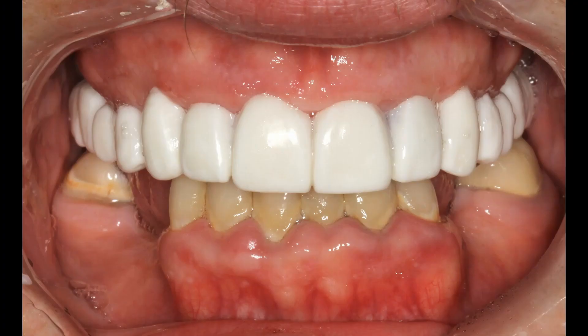This is the picture of the wax try-in. As you've seen in other videos, the wax try-in is how we assure for ourselves, the patient, and their families that the patient is getting the tooth shape that we all want for the best possible outcome. We've fast-forwarded here by several months — all of the teeth are out, additional implants have been placed, and now the patient has worn a fixed temporary for approximately five months. Any changes we make from the temporary to the permanent are conveyed to the lab, and then we verify those changes at this wax try-in appointment.